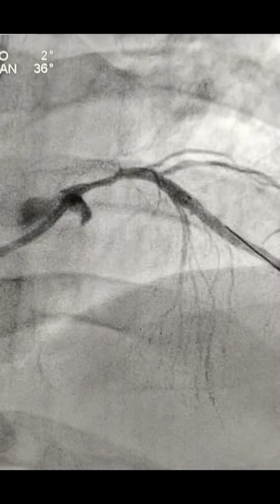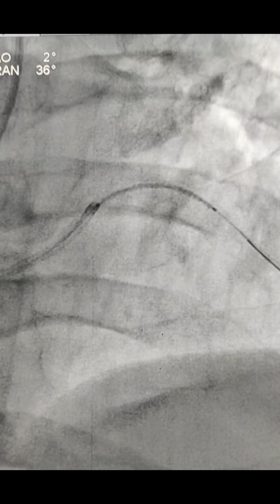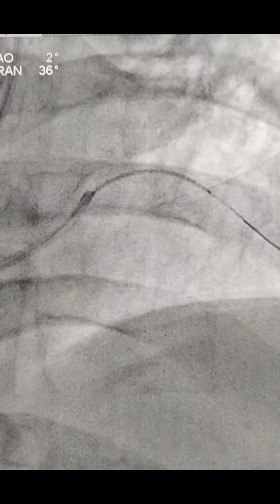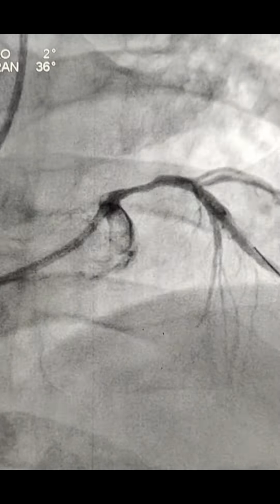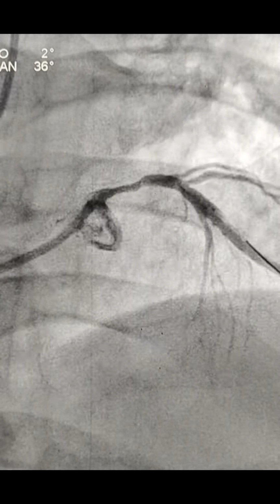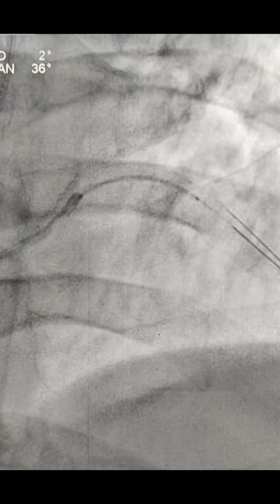So this was the placement of the stent right from the ostium of this anomalous LAD origin. This was not a straightforward origin of the LAD. In the later stage, after deployment of the stent and taking a stent boost, I'll show you the origin of this LAD, how anomalous it was.